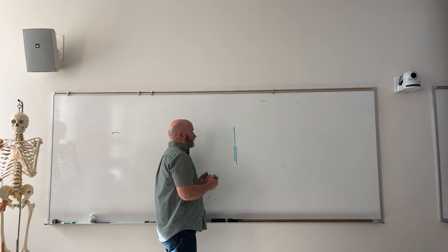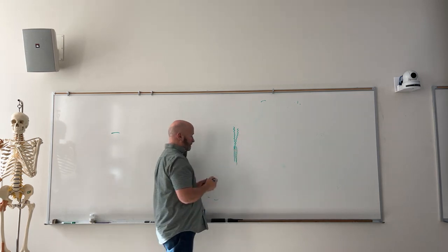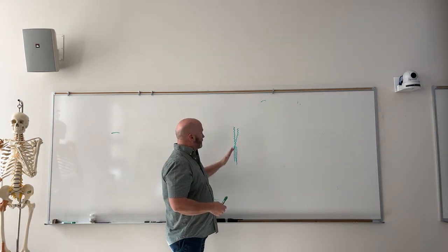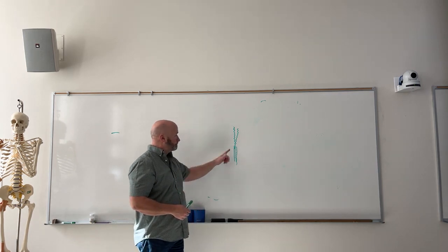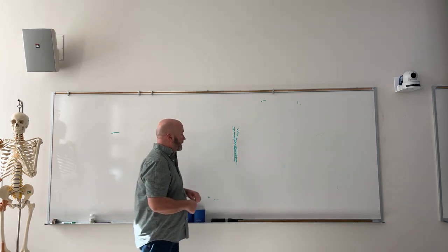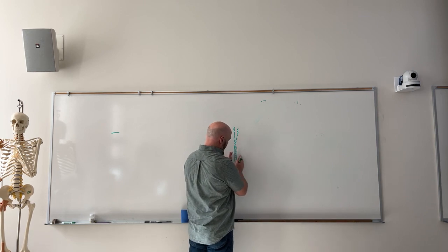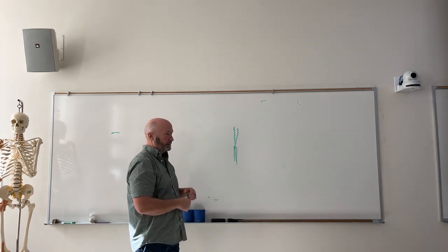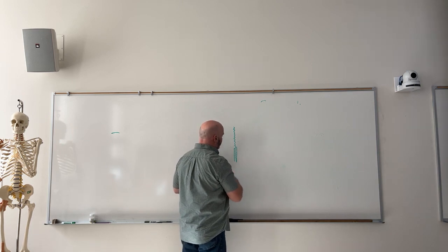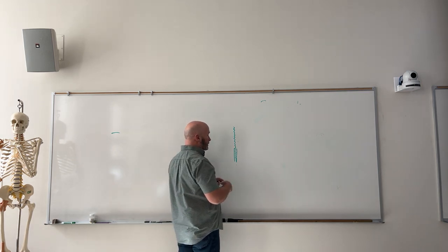Okay? So the tricky thing about it is that if you are off just a little bit in your positioning, be it with the X-ray beam or with the positioning of the grid, then the X-ray photons are going to hit the sides of the grid strip, and they're going to be absorbed, right? So a lot goes into the construction of a grid, and the attempt to make these little strips or these radiolucent areas parallel to the X-ray beam. All right, so a lot of different ways that we can make them to where they'll transmit X-rays, but absorb scattered X-rays.